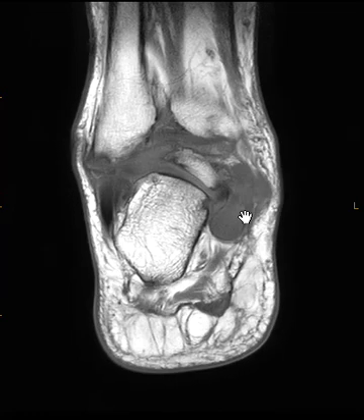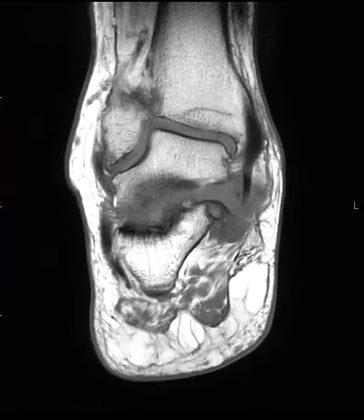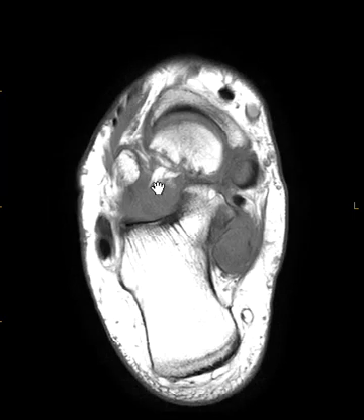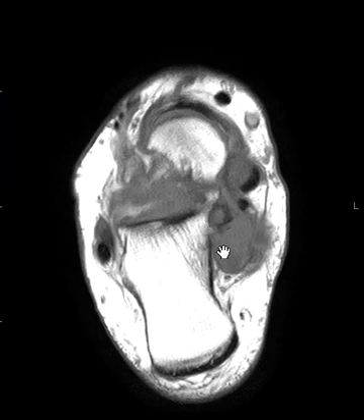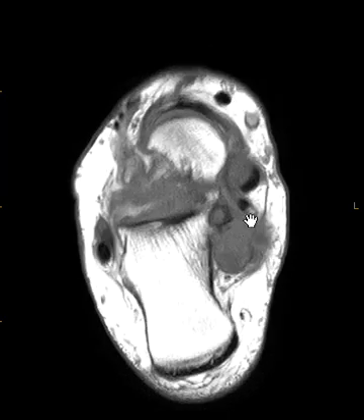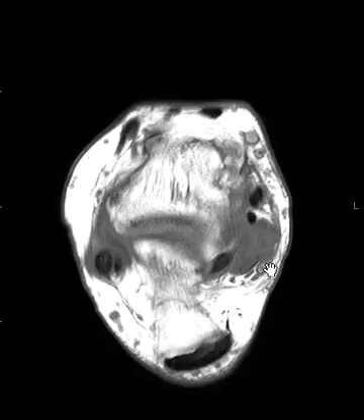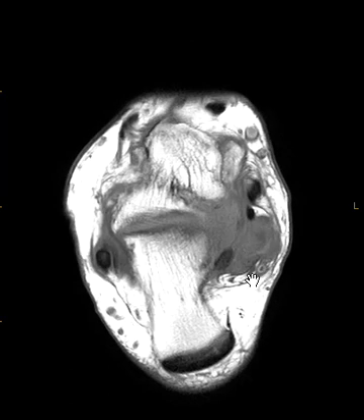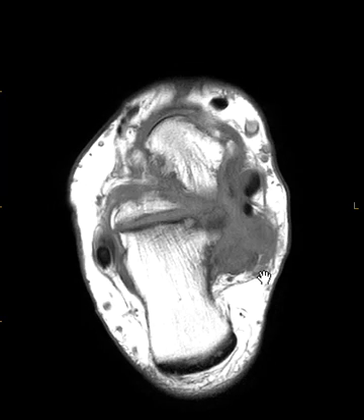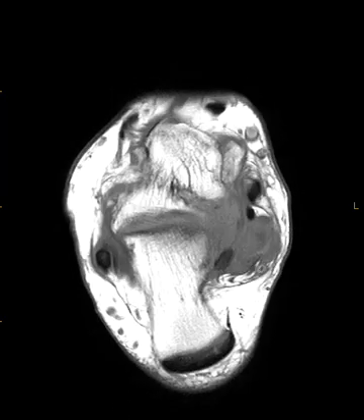Let's look at an axial view. Getting our bearings: here's the sinus tarsi, and here's this big process over here in the region of the tarsal tunnel. The vessels are over here and the tibial nerve is over here — these little dots represent the neurovascular structures of the tarsal tunnel. So this process goes backward between the flexor digitorum and flexor hallucis, fills the tarsal tunnel, and pushes on these neurovascular structures.